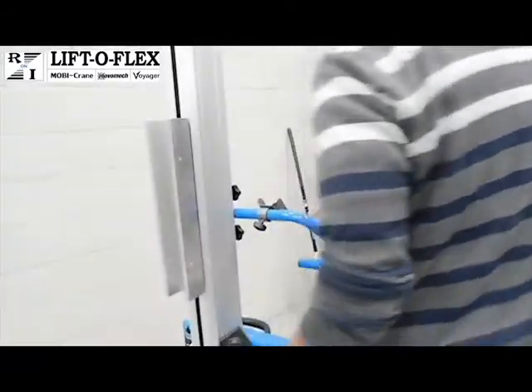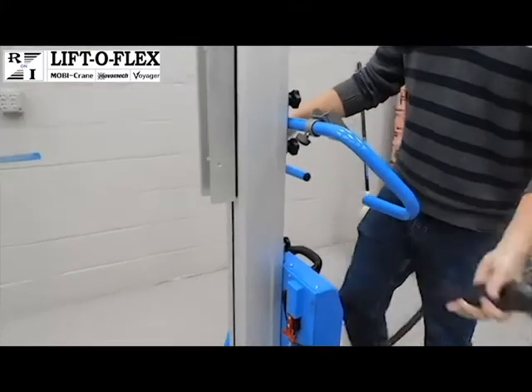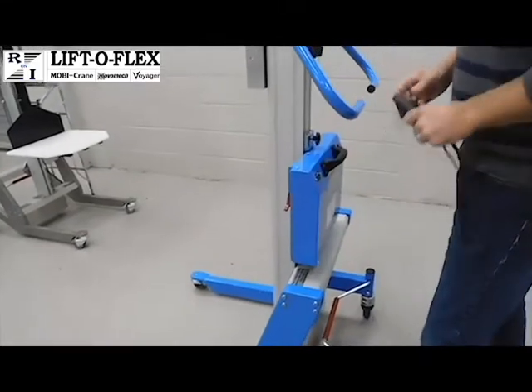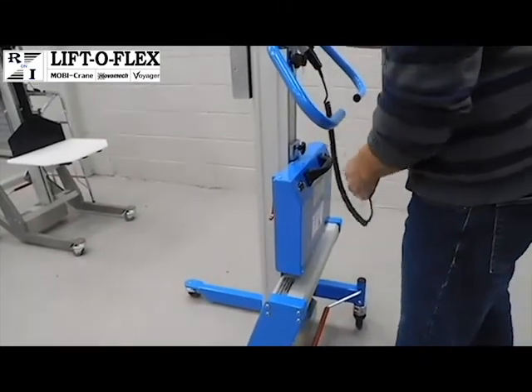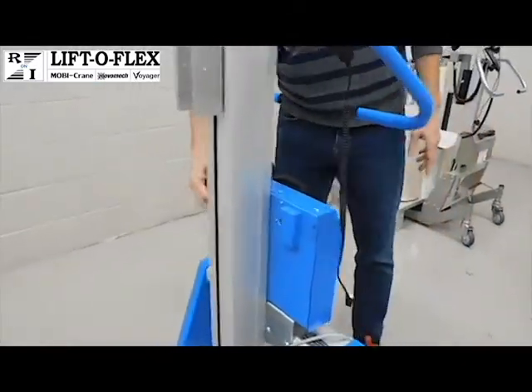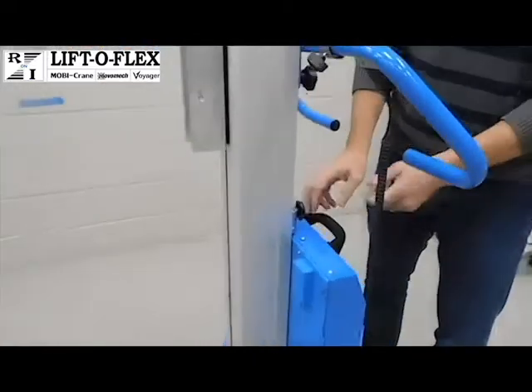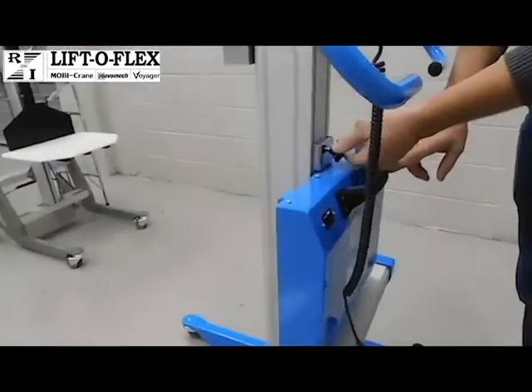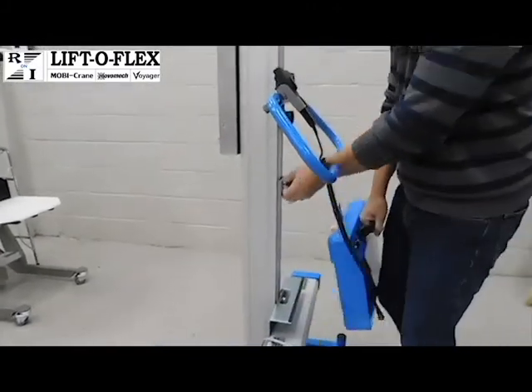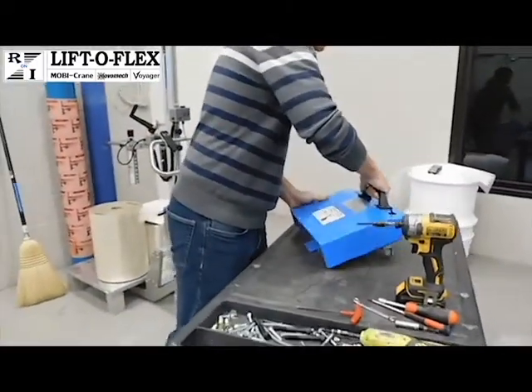To do the rest of the repairs inside, the power pack will need to be removed from the lifter. So put the brake on the lifter. We'll go ahead and remove the hand control. Disconnect the power to the motor. Disconnect any auxiliary cables, which would be the light. Loosen the knob on the power pack. Slide the bracket up and pull the power pack off the lifter. If you have a cart or table, you would put the power pack down on that.